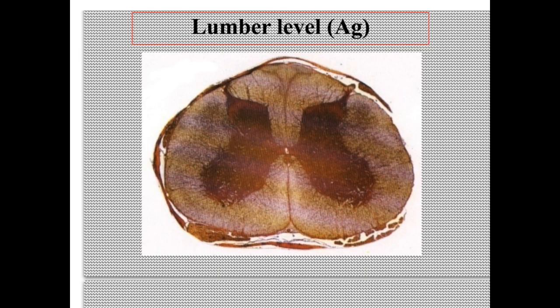In case of the lumbar, it is very easy. It looks like two half boots. This is the half boot, and this is another half boot. We have the four horns thick, and first of all, as I have mentioned before, it is a spinal cord. Why? Because of the presence of a central canal and the H-shaped gray matter. So first word, spinal cord. Between two brackets, it is the lumbar. We have the four thick horns, and the posterior horns are thick and parallel.